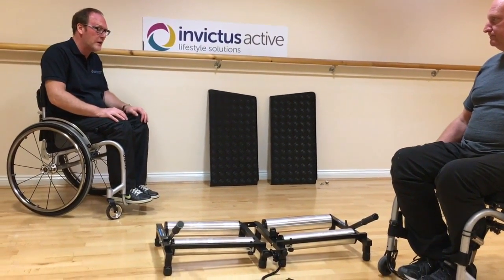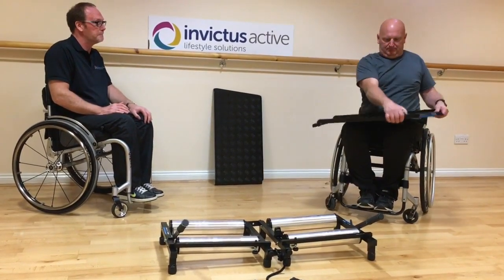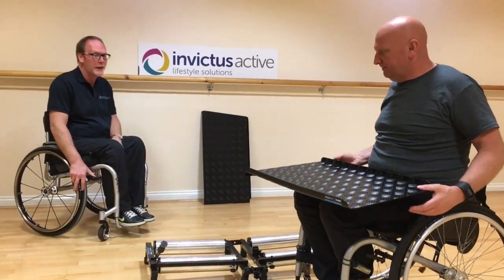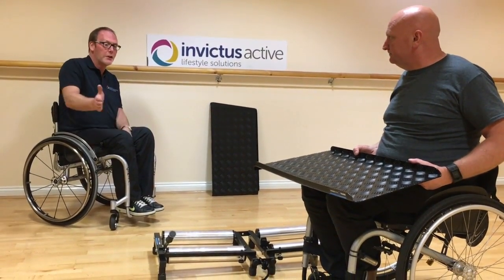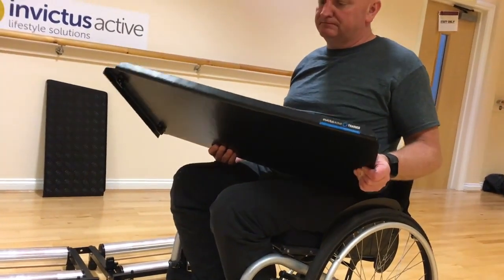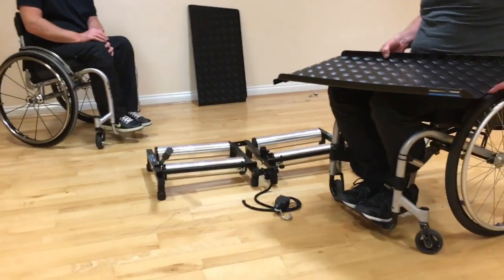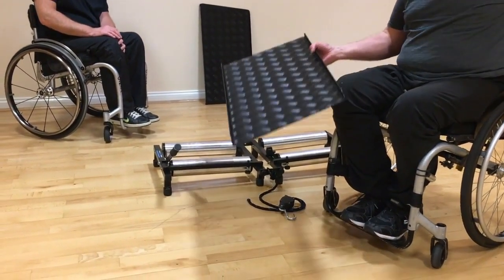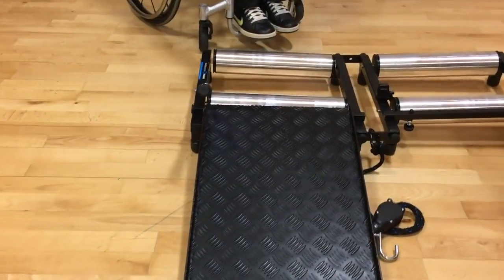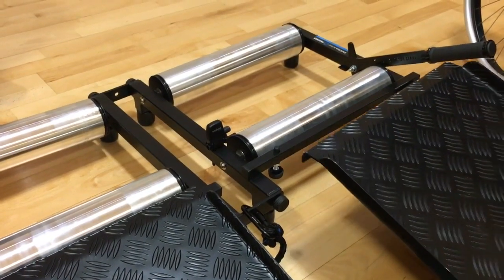The final part of the assembly process is putting the ramps on. Grab a pair of ramps. When putting the ramps on, the long side of the ramp needs to go on the outside of the trainer. You can also identify the correct orientation by matching up the stickers on the outside of the ramp. The ramp has to sit level with the two black spacers on the roller, then position the ramp so it sits flush with the thumb nut.